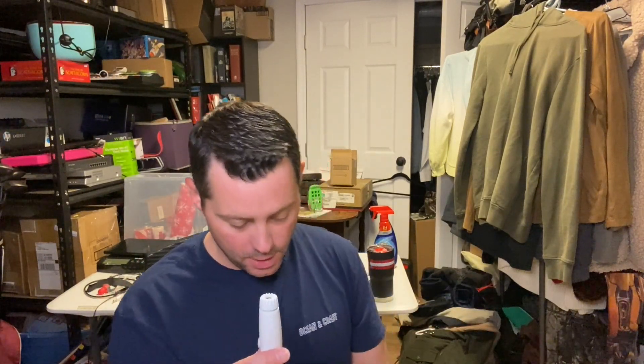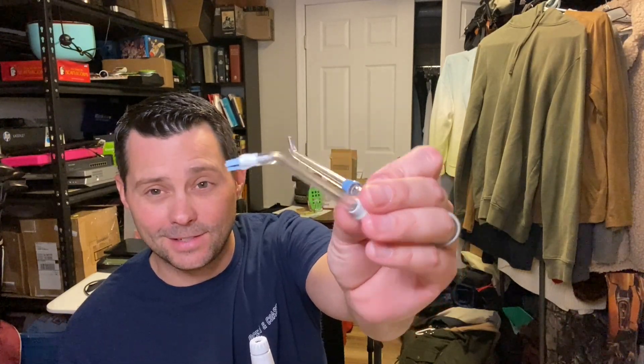You're going to use this little piece right here and you're going to pop on one of the different types of tips that you have. These are just two of the tips — the basic tip it came with and also I think this one is called the Plaque Seeker. These are really cool — all you have to do is take this little handle right here and pop on the tips.